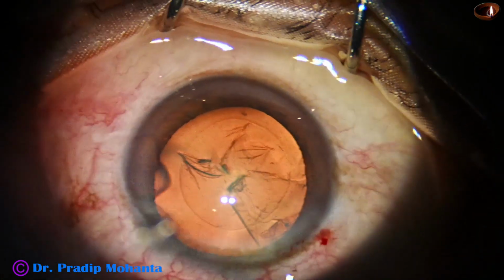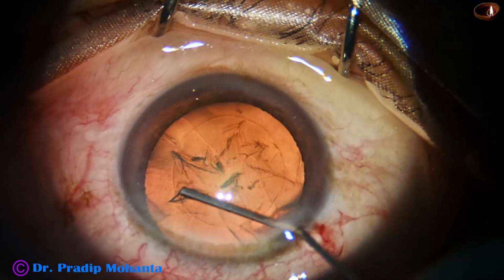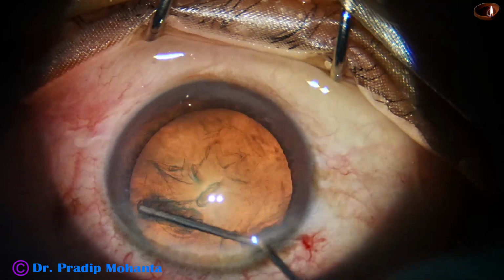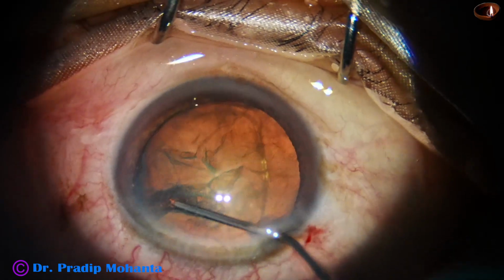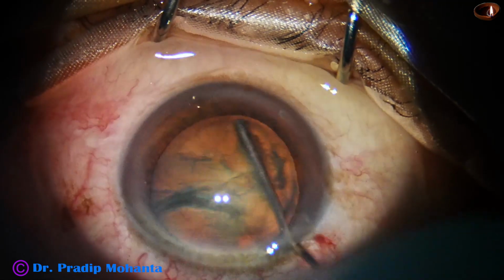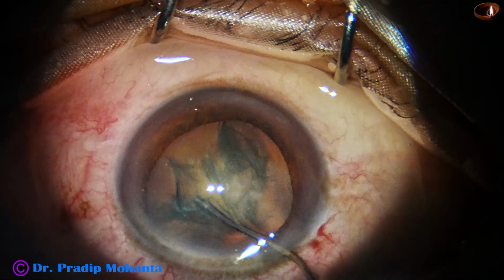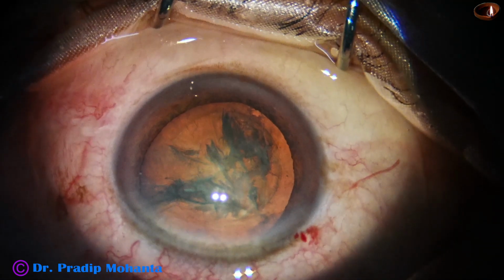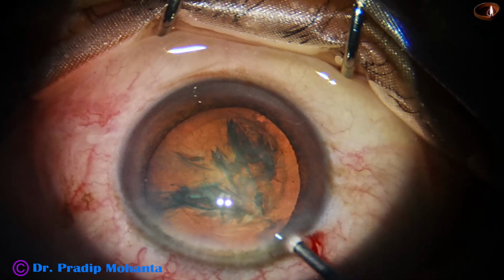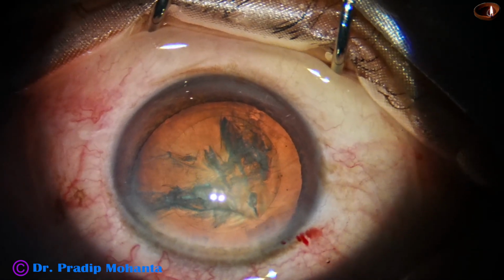Now, a very important step, hydrodissection. Rent may occur at this stage. This is the first flow, this is another flow, this is the third flow. So with these 3 flows, I don't know whether this caused the rent itself. Probably one flow is good enough in hydrodissection, but still I am not sure whether the rent has occurred or not.